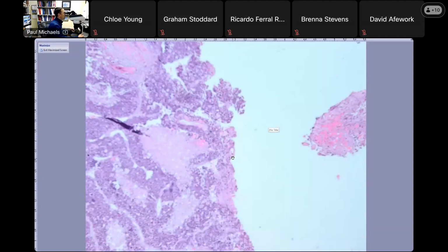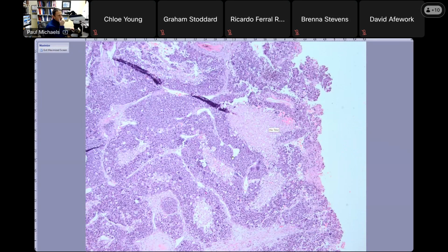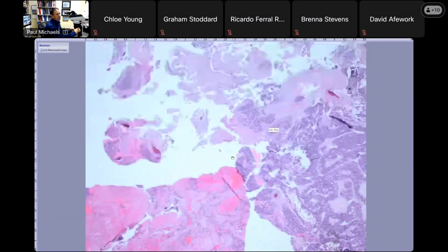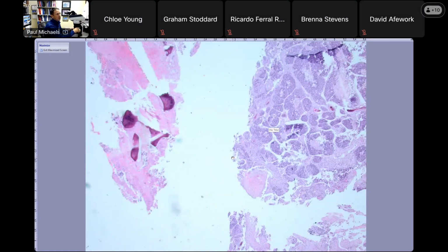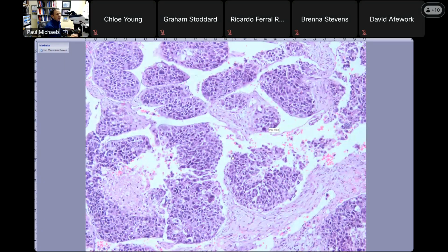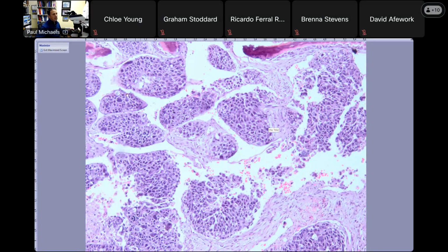This is one that I've seen a bunch, and it's not in the top 5 for going to bone, but it is one. So this is hepatocellular. I've seen a bunch of hepatocellular carcinomas be in the bone. This is one where they have a history. So here's the fragments of bone, and it has this very poorly differentiated HCC pattern, but it does have that sinusoidal wrapping that you see in cytology and in histology. But again, I think if you just had this without a history, the architecture should make you suspicious.